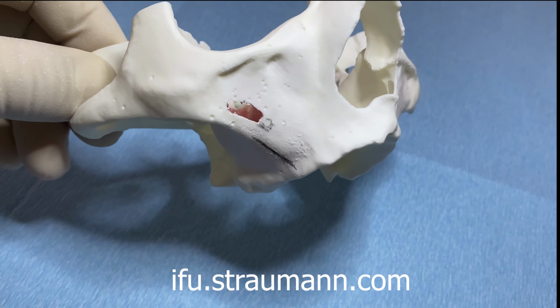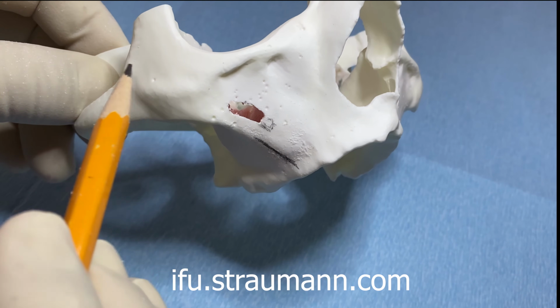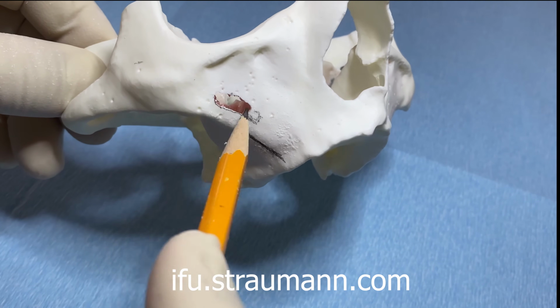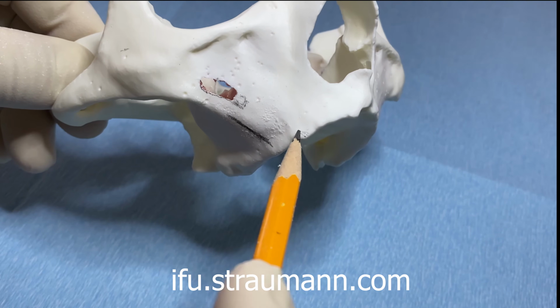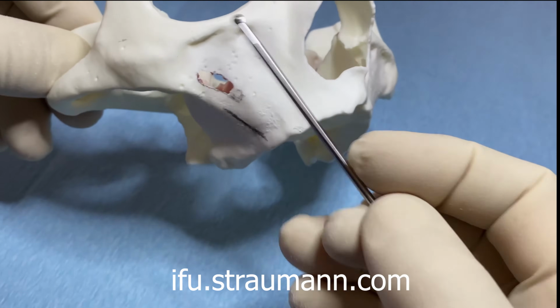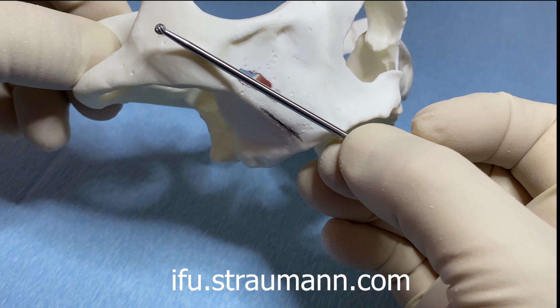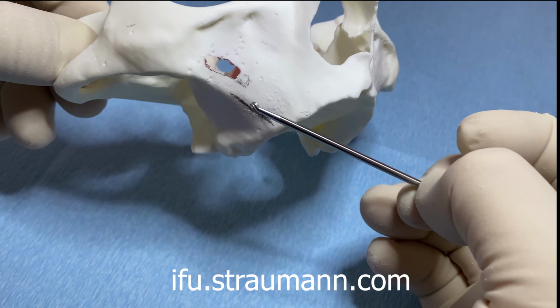So if I was to mark that again for purposes of demonstration, if my implant apex is here somewhere, my shaft or the middle portion of the implant is here somewhere, then the origin is going to be right here at the second bicuspid. And again, if I was to measure this or show myself, I would put the drill there, and that's where it is. So this is the trajectory that I would like to start.